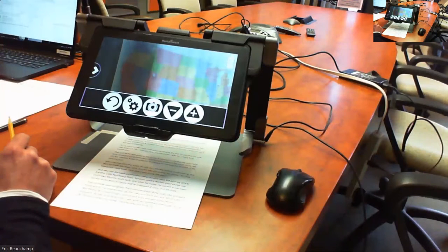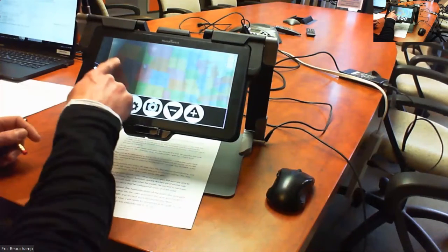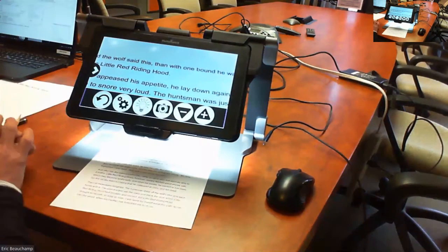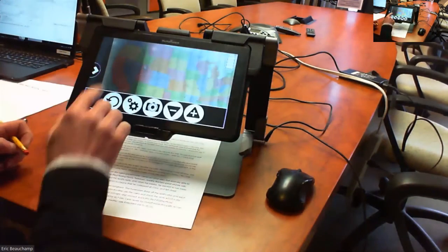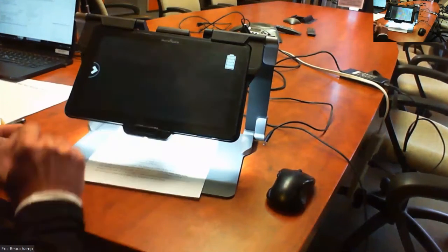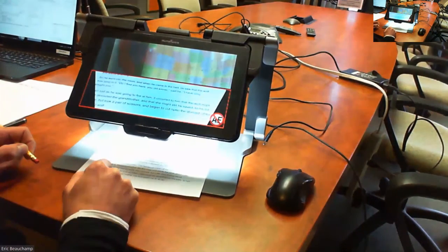Ever since I started, I can just move the camera, put it closer, move it left to right, up and down. And then again, swipe back to the magnifier. If I don't like that focus all the time, lock it in, double tap, and then you can just go back and forth. Now the focus is never redone. You have that clear image in the near mode, and you can just read at the same time as seeing the teacher. If I want to have that split mode again, click on that arrow on the left-hand side, and you have the split screen feature.